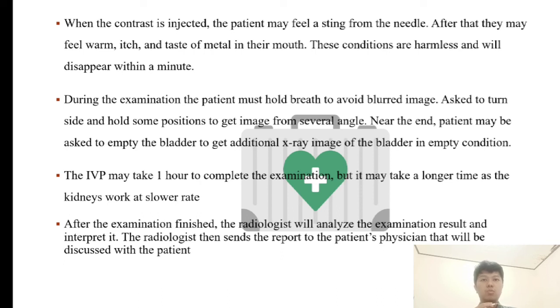The IVP may take 1 hour to complete, but it may take longer as the kidneys work at a slower rate. After the examination is finished, the radiologist will analyze and interpret the result, and then send the report to the patient's physician, which will be discussed with the patient.